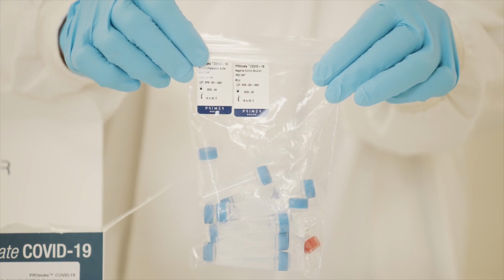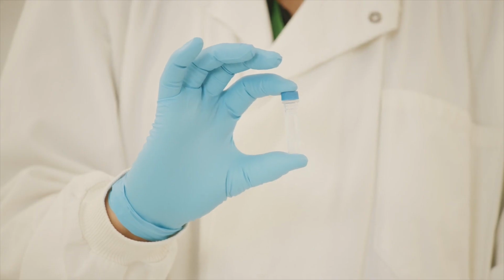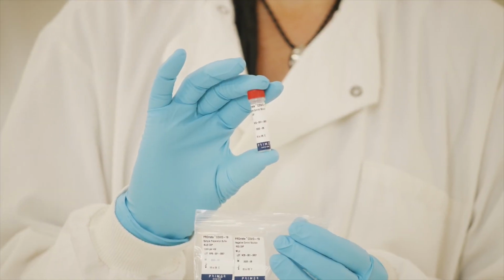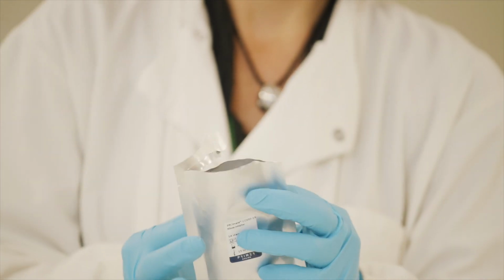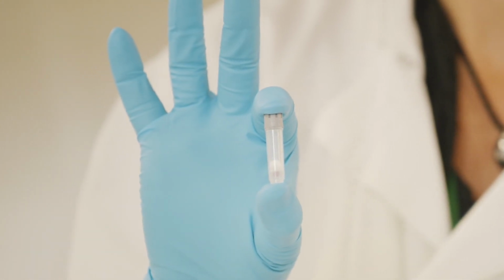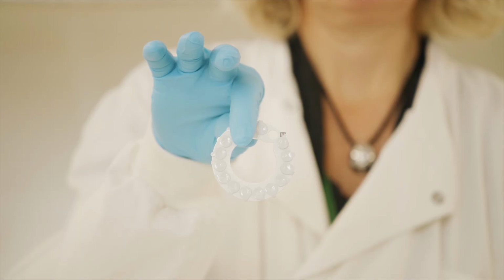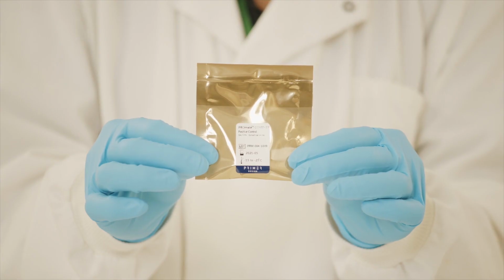Upon opening Pack 1, you will find clear bags which contain the sample preparation buffer tubes and negative control solution, and RNase inhibitor with red bead. Pack 2, in the large silver pouch, contains the reaction magazines and the positive control foils.